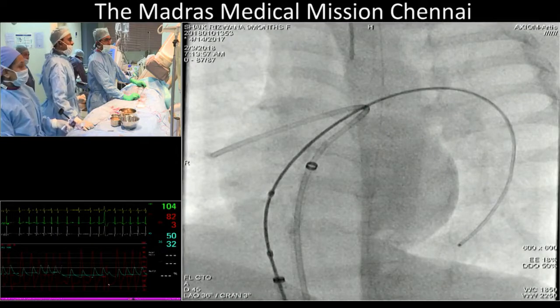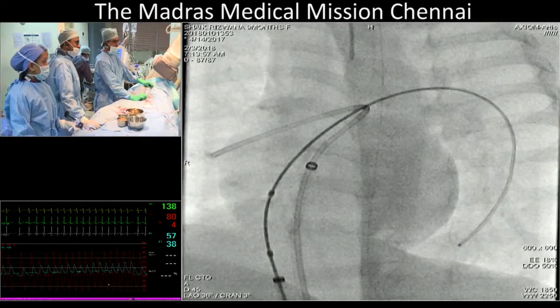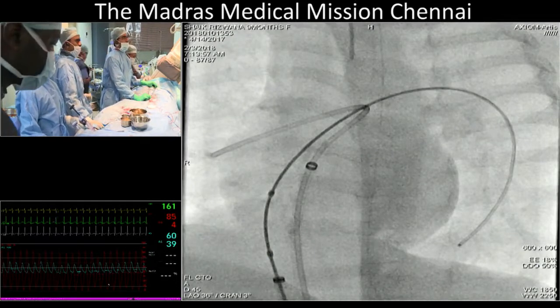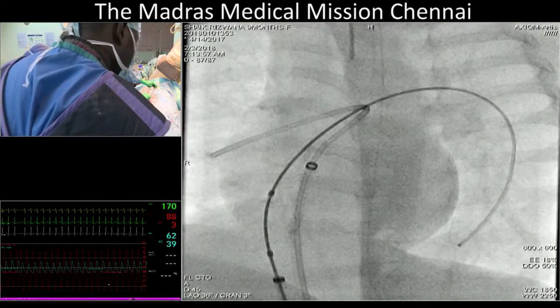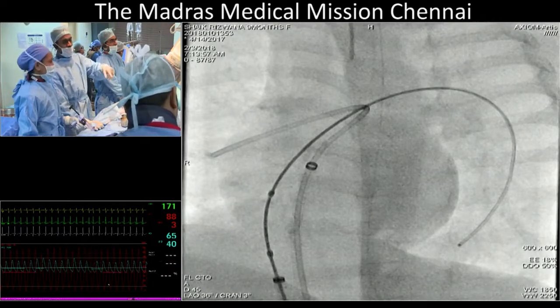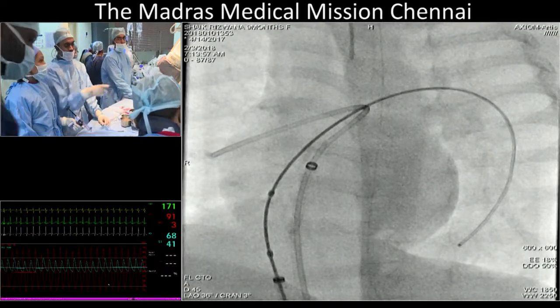See the hilar left pulmonary. Show that LPA before. The previous LPA picture. Siva, can you once again? We are trying to get the LPA. Show the previous LPA movie.